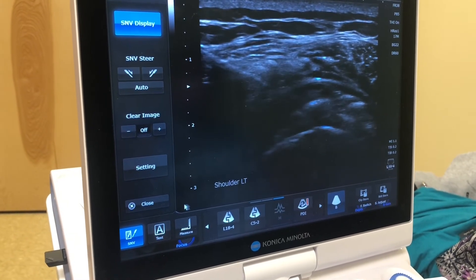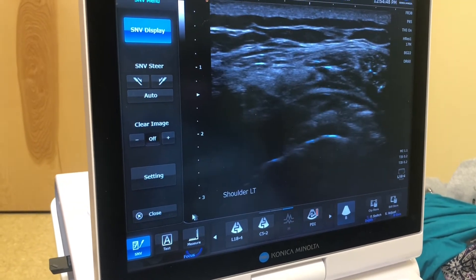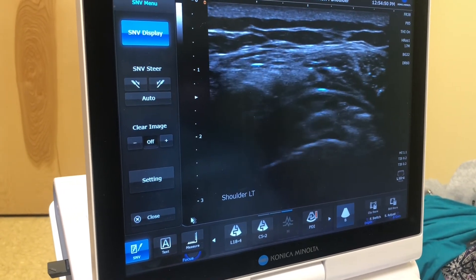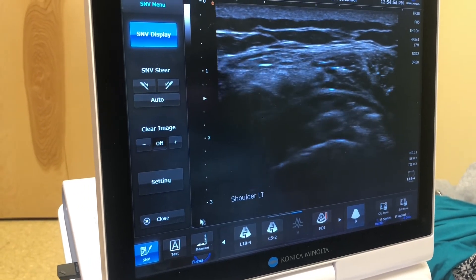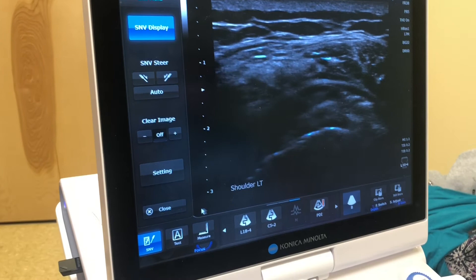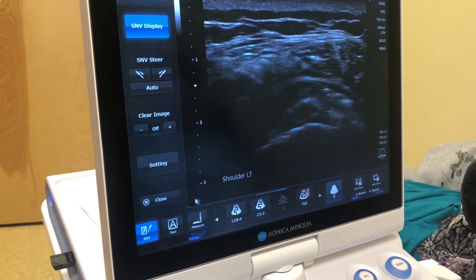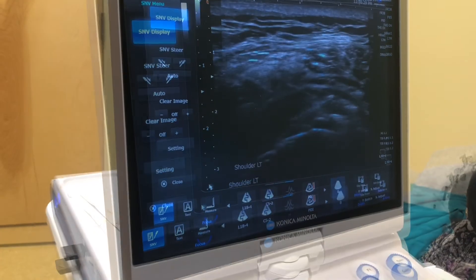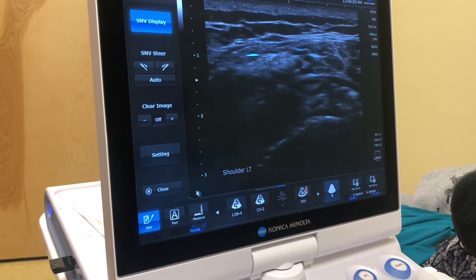The patient is positioned again in the same position as previously. We identify the deposit on ultrasound and then insert an 18 gauge needle with the saline attached to it down into the calcification. We put pressure on the syringe to inject the saline into the deposit, as you can see it rising and falling with each push of the syringe.